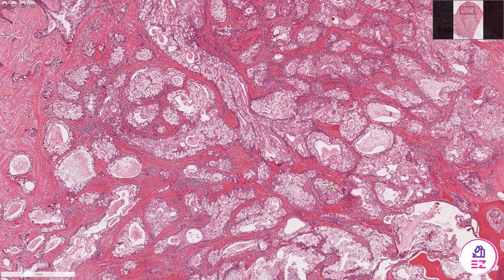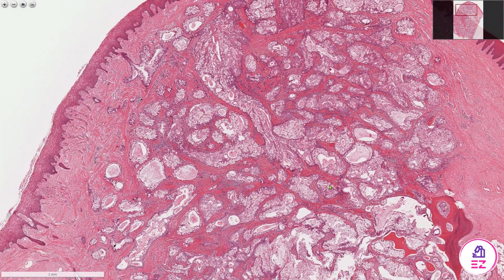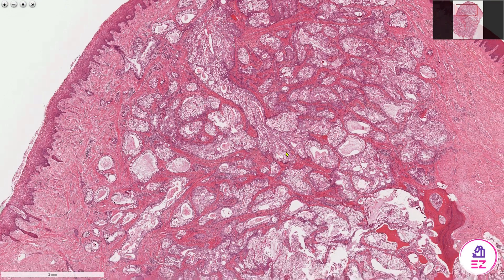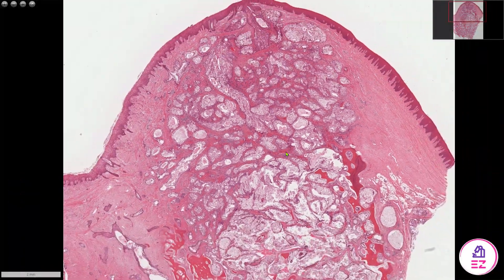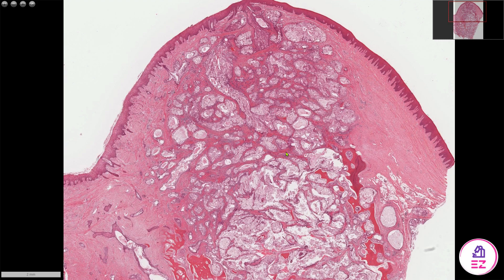Mucoepidermoid carcinomas are graded from low to high grade. This particular example would probably fit low to intermediate type, because it has both solid and cystic components. Generally, if it has a lot of mucous cells and cysts it's low grade, and something more solid with few mucous cells and evidence of necrosis or perineural invasion would make it fit better in a high grade category.